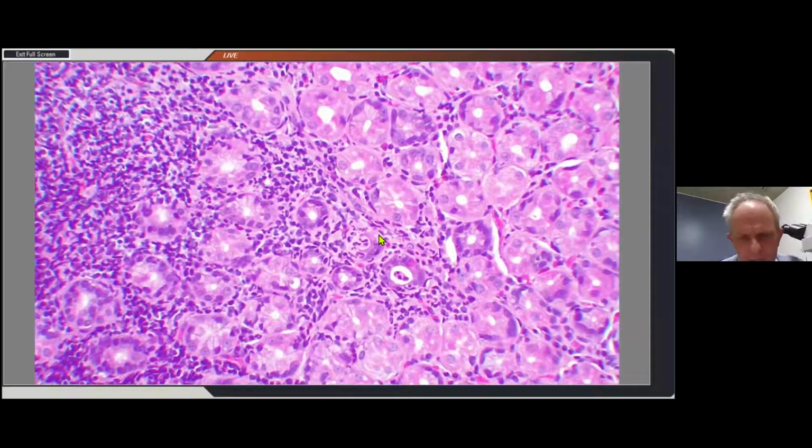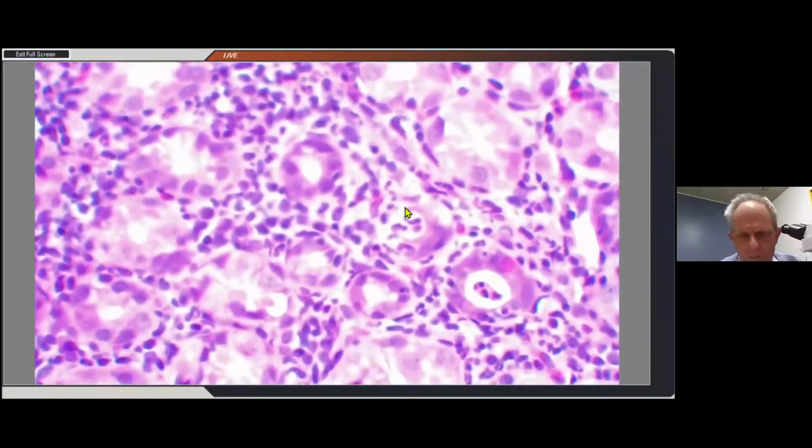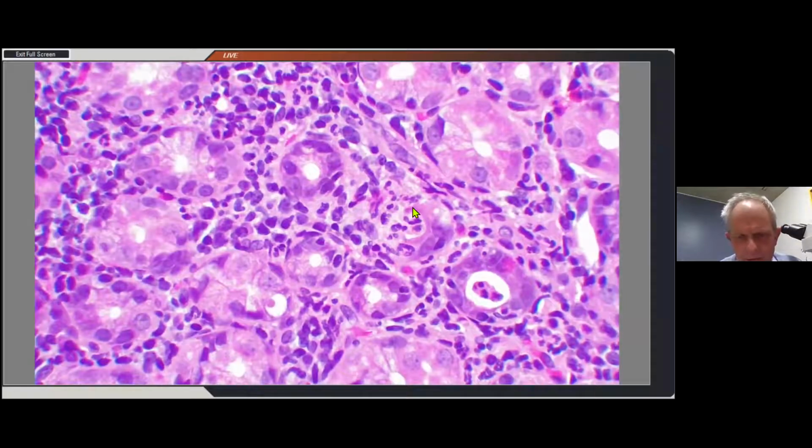And if you look here, for example, we can see that there's a gastric crypt there, and neutrophils migrating into this. So this is almost pathognomonic then of Helicobacter pylori infection. You can see that the neutrophils are migrating in, forming a crypt abscess. And in this area here, you've got intraluminal neutrophils.